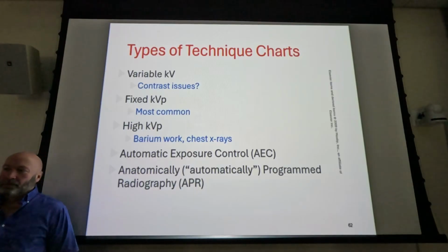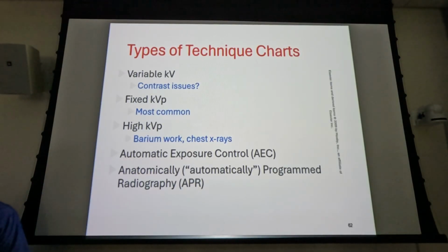So then what happens if you're phototiming and you use 110 kVp on an asthenic patient versus a hypersthenic patient? What changes? You use the exact same kVp. The amount of tissue. The amount of tissue that you're going to penetrate, and the amount of the x-ray the hypersthenic patient is going to attenuate.